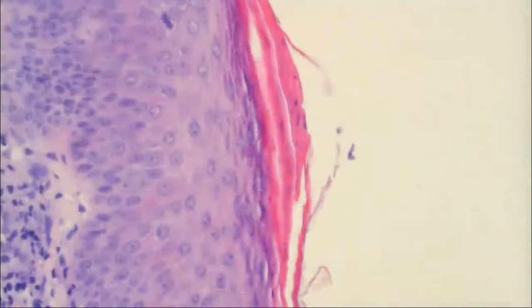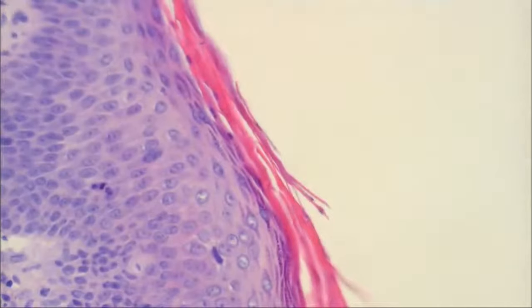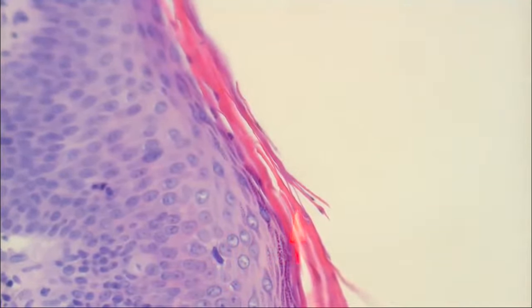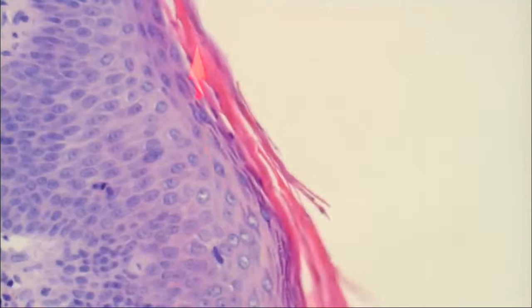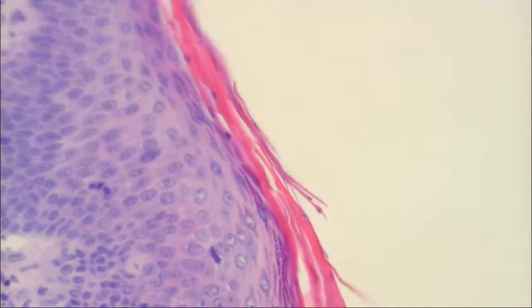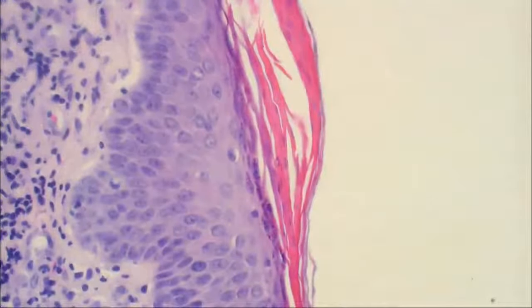Now, why is it not candidiasis? The shape would be different basically. Okay, that's one thing. Another thing is tinea likes the cornified layer, candida likes the epithelium. So candida will grow down at 90-degree angles like this, getting into the epithelium, trying to drill for oil. This stuff likes to sit up here in the cornified layer. It's perfectly happy munching on the stratum corneum, producing little holes from carbon dioxide that it manufactures. So this is tinea.